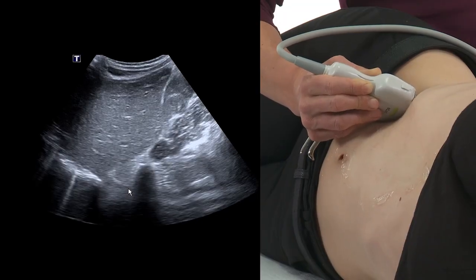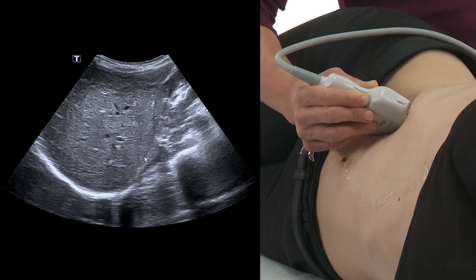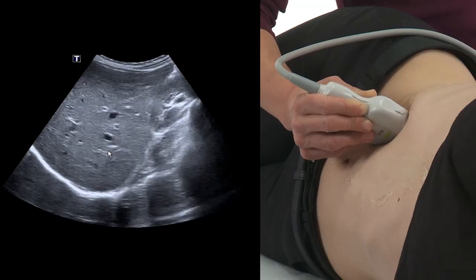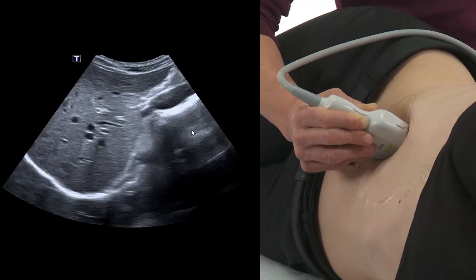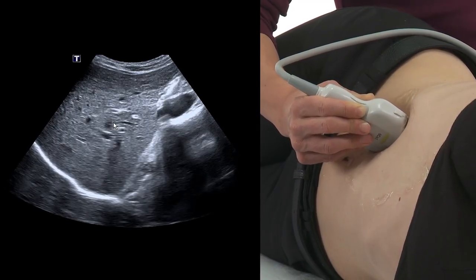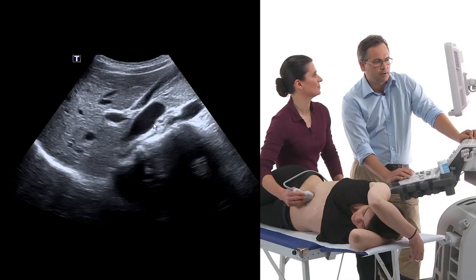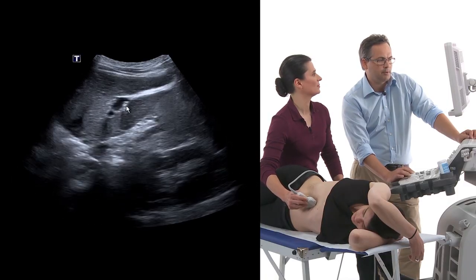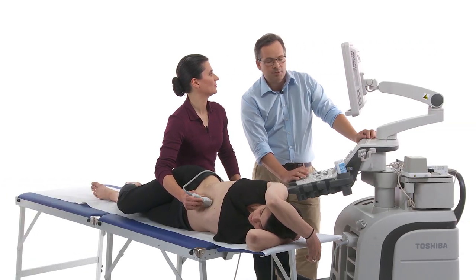And now I go all the way back. So we focus on the caudal border of the liver and scan the parenchyma of the liver. Kidney over here. Back to the midline. Exhale and inhale, please. So, and now back to the midline again. Vena cava over here. The right renal artery here. Portal vein. And back to the midline.